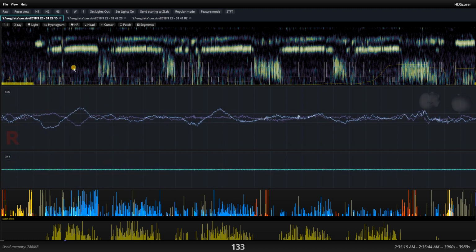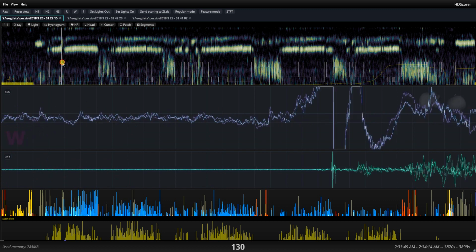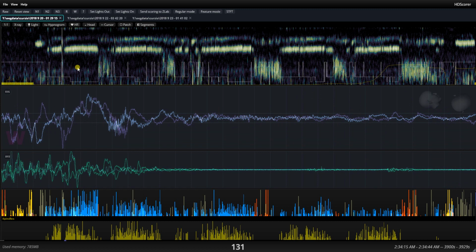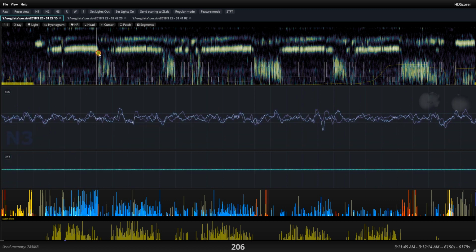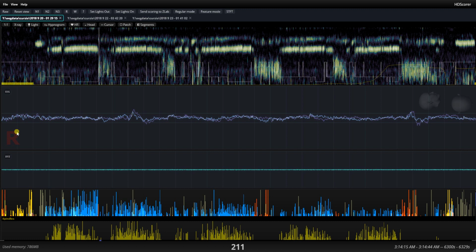Okay, but the bottom line is that we were able to catch both this awakening and this awakening on the hypnogram very accurately, and that's great. Now we have here a period of confusion. Why do I say confusion? You see how choppy this alpha activity is. This is a period in which sleep is really not that stable at all. So for example, here we got an eye movement, but we also have spindles, which is why it got characterized as N2. Moving on, we have REM sleep.